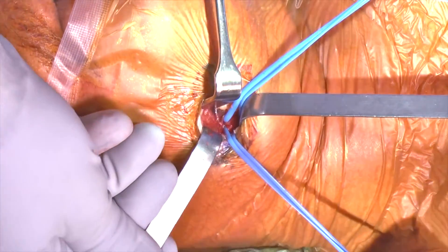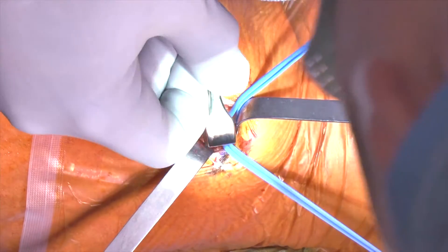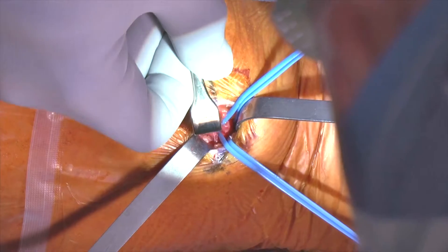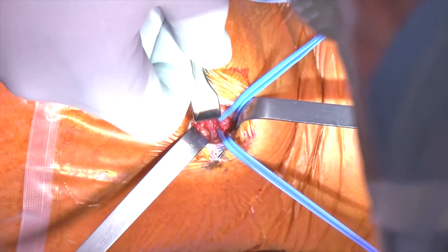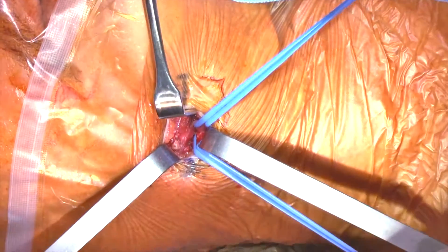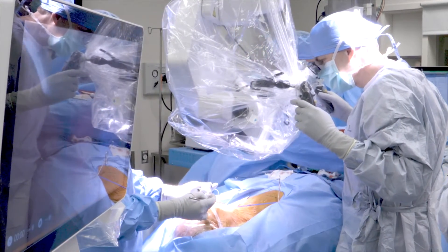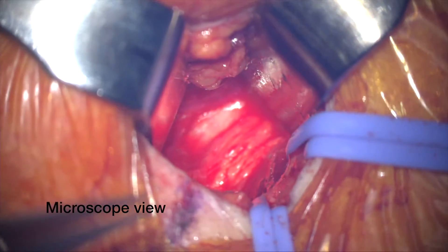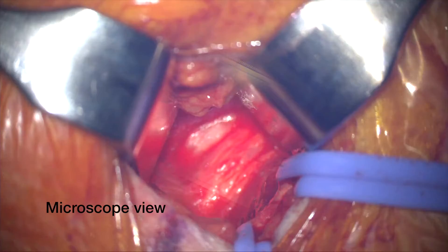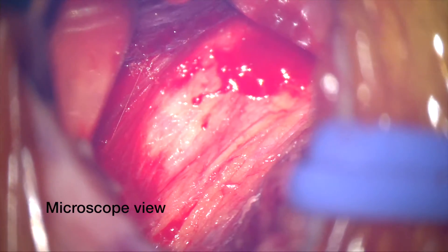Once we have the digastric tendon retracted inferiorly, we're going to identify the lateral edge of the mylohyoid muscle. Once we see that, we're going to get right underneath that lateral edge and retract anteriorly, which is going to present us with the hypoglossal nerve. Next, we'll bring the microscope into the field. I really do feel that microscopic assistance in this procedure is key to identifying those pesky branches that can lead to some poor outcomes.